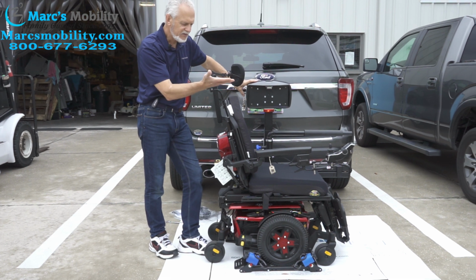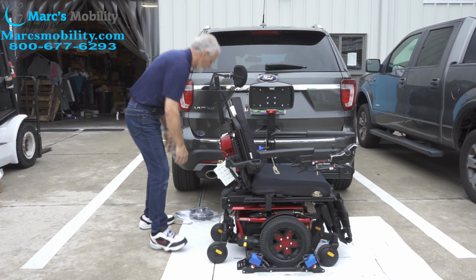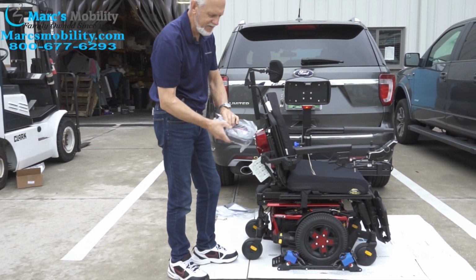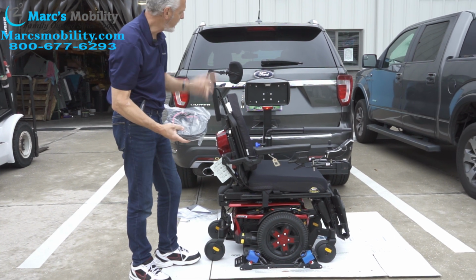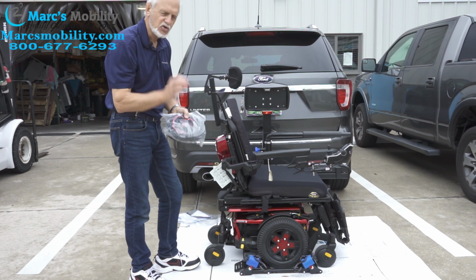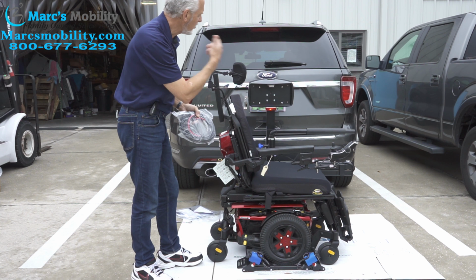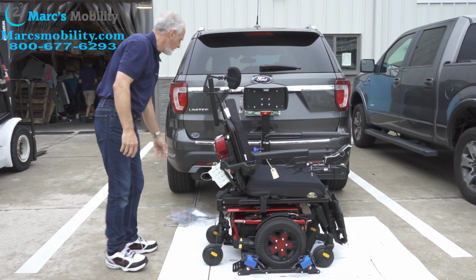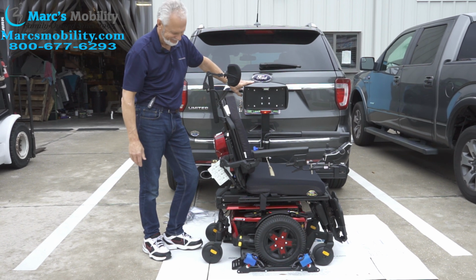When you raise the lift up, always run your car, okay? So you will get a harness like this harness right here that comes with your lift. It's a heavy duty harness. This has to be run from the battery of your car to the back. Now my car already has the harness on it, but we ask that you run your engine when you raise these 400 pound plus chairs. It'll give you a little more power to your motor. It'll make it easier on your lift. Now I'm not going to run the car right now, but you should.